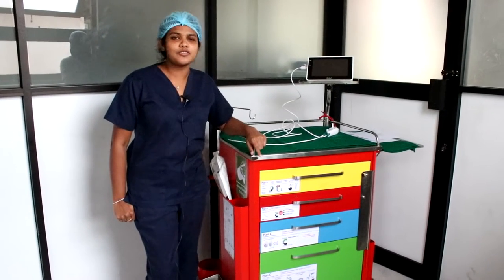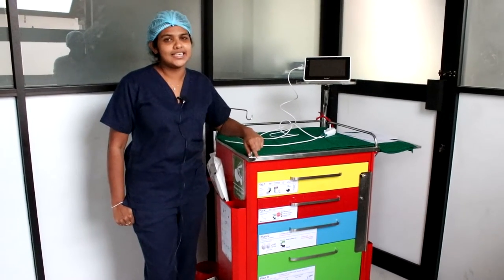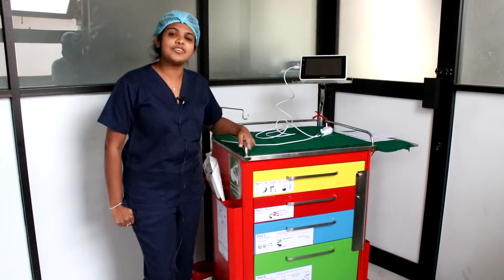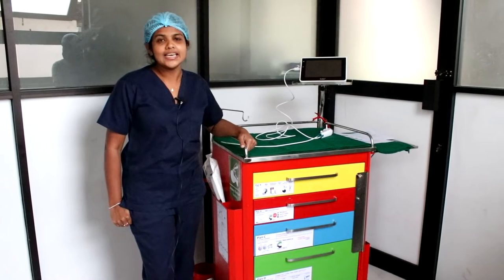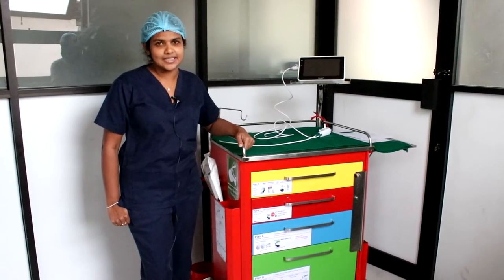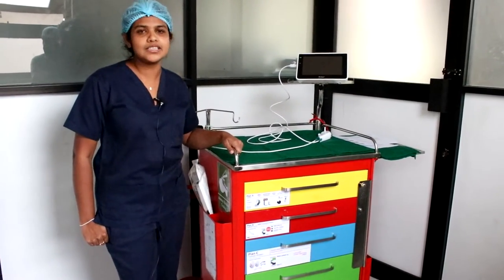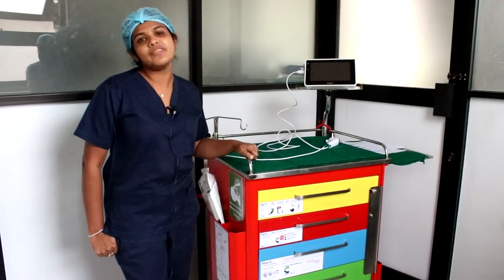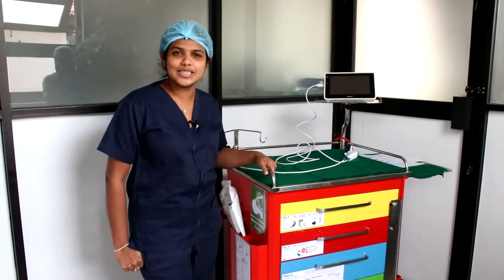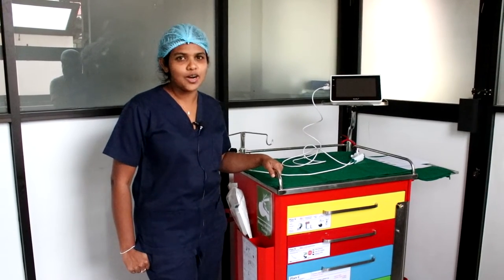We, the Department of Anesthesiology and Critical Care of Faculty of Medicine Pera Ardenia, have created this difficult intubation trolley in accordance with the Difficult Airway Society guidelines. This trolley will be stored in between Theatre 4 and Theatre 5, so that it will be very easy to take it in an emergency to both sides of the theatre complex.